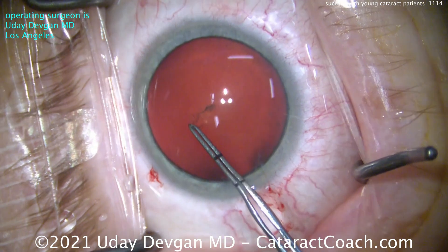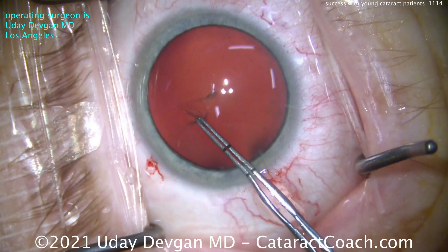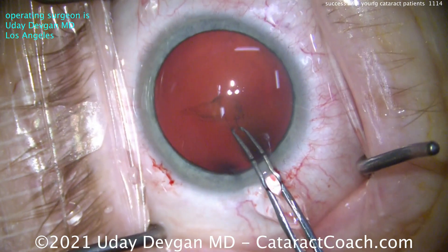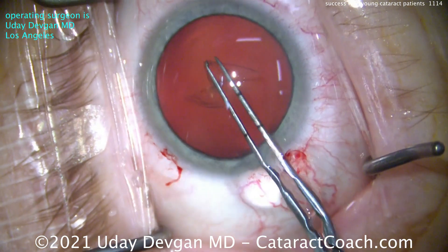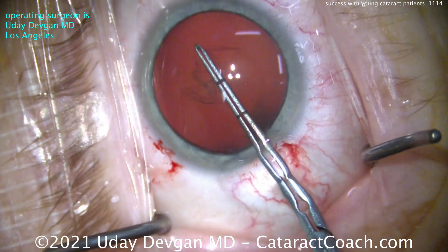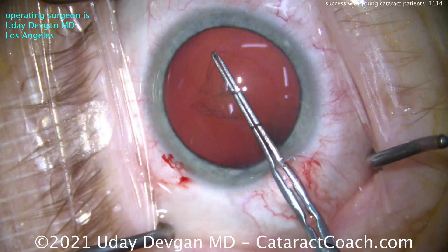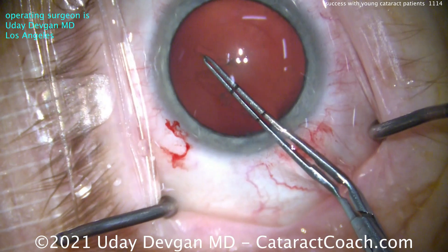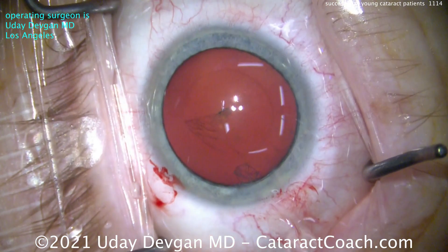Now we're going to enter the lens capsule, and this lens capsule can be more elastic at this young age — this patient's about 40 years old. So now we're tearing the capsulorhexis, and this needs to be precise. You see my forceps? This is my design — they're marked off at 2.5 and 5 millimeters on the tip. So when you create this rhexis, we can actually measure it out and make sure it is exactly the 5 millimeters that we want, and it's beautifully centered. That measures at 5 millimeters.